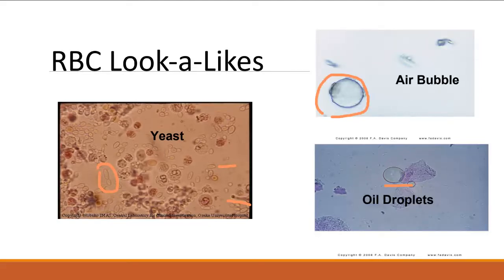You can also have, we haven't looked at crystals yet, but you can have calcium oxalate crystals that can look like red blood cells. But in a case like that, you will probably also be seeing some calcium oxalate crystals in a different type of shape. Crystals can take on more than one shape. So when you start studying for those, you need to know different ways that they can look.